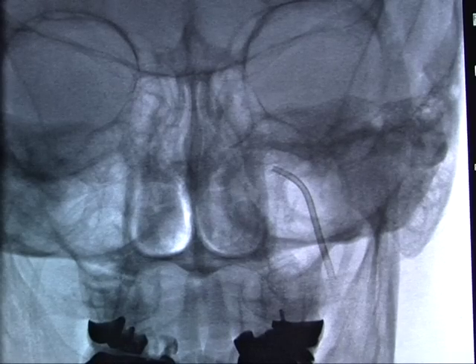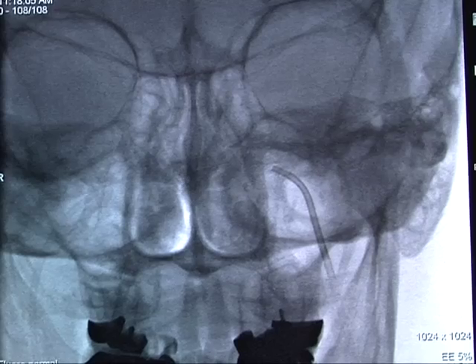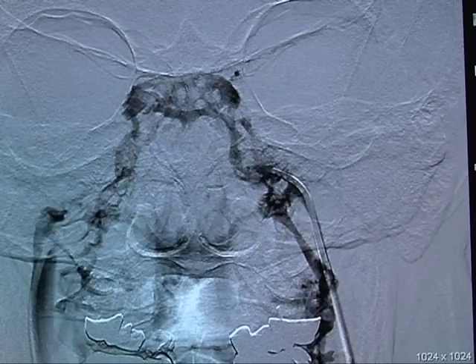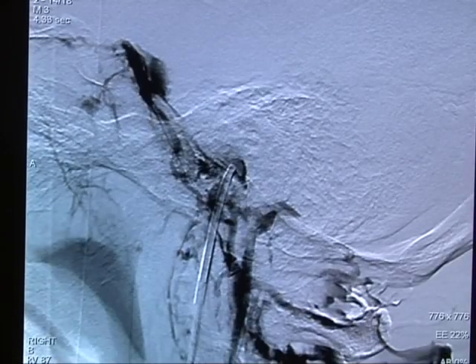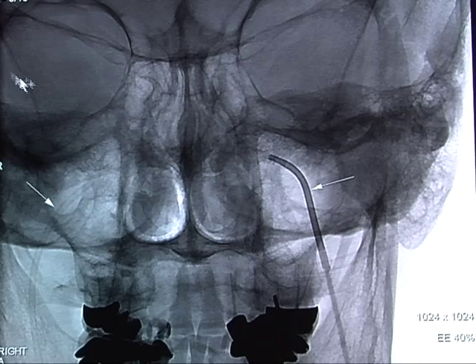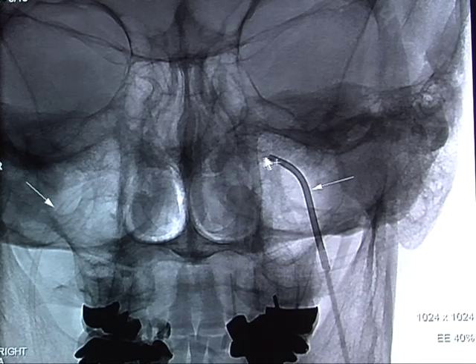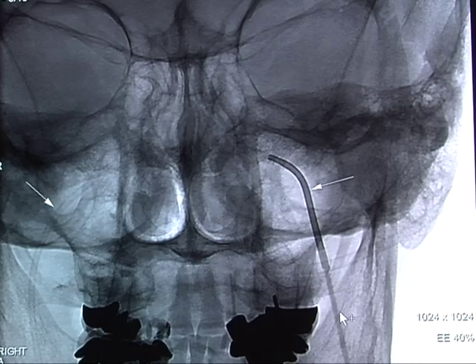The catheter is being advanced along the wire into the inferior petrosal sinus. We have now catheterized both right and left inferior petrosal sinuses. A venography run is done, showing good filling of all sinuses. A lateral view shows filling of the sinuses.